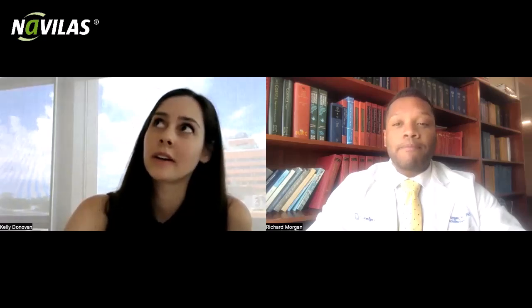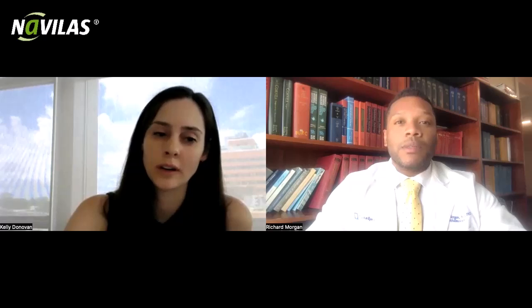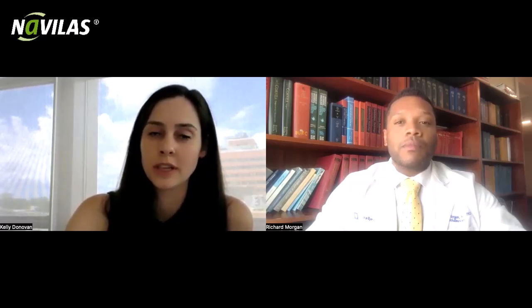Yeah, I agree with that. If a patient had a really small hole or even a tear that was not super peripheral and wasn't difficult to see, I think probably it'd be easier to just whip out your slit lamp or your indirect. But for patients who need more laser than that, even though there's a little bit of extra setup time with the Navilas, in those cases it's definitely worth it because you gain so much extra time during the treatment phase. Yeah, absolutely.